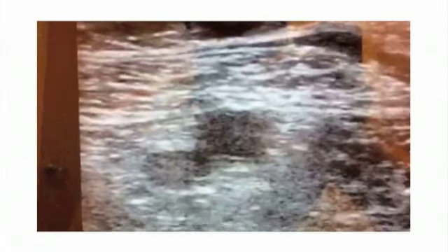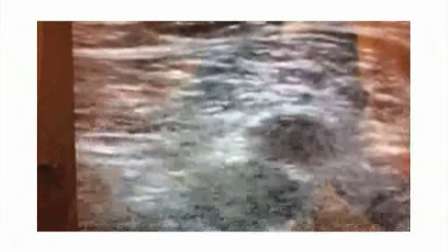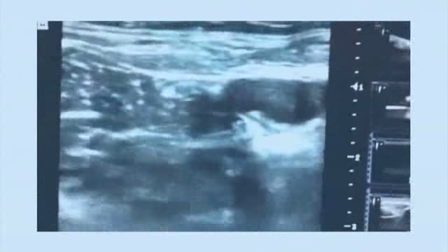What about this one? Compressing? No. This is another popliteal vein. Looks very similar. Artery, vein, but that is not compressing at all. Would you agree? Agreed. Not compressing. DVT. Anticoagulate. Oh, normal. Normal. Oh, wait a second. Don't get crazy. You want to go up to that saphenous takeoff. Oh, yeah, nice. Nice technique. Now and then there, you compress here? Yes. Look at that. Do you see that segue? This is great. So no DVT.